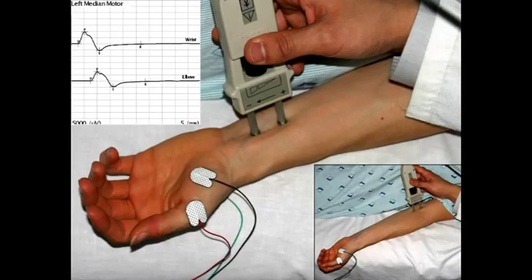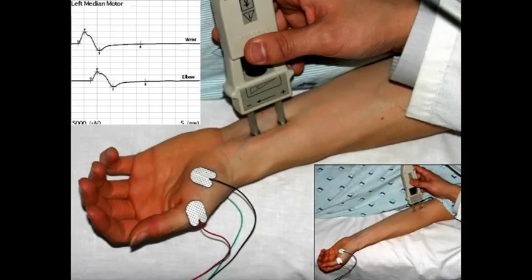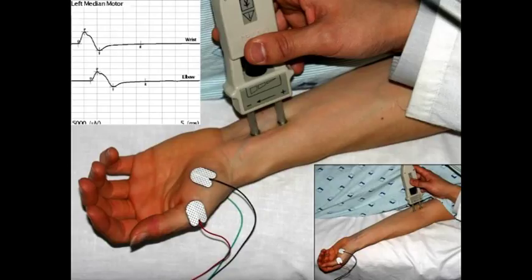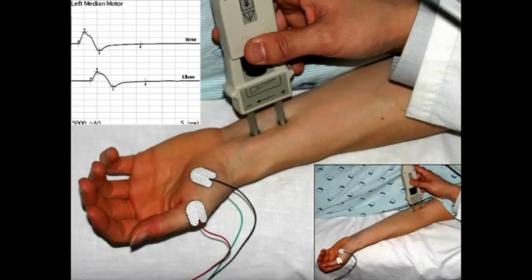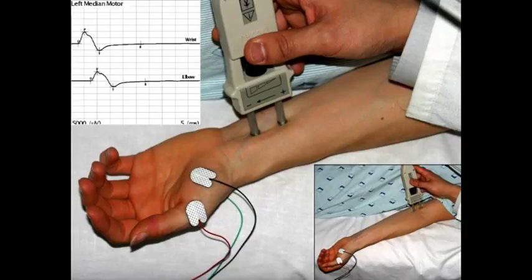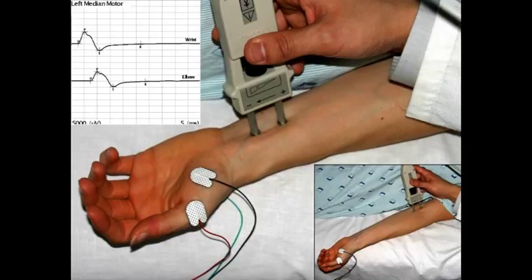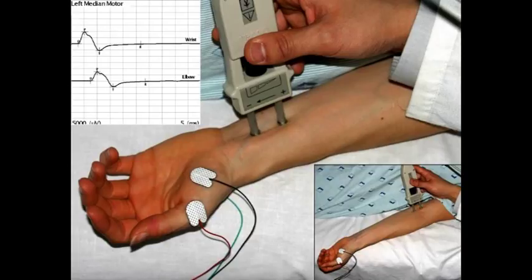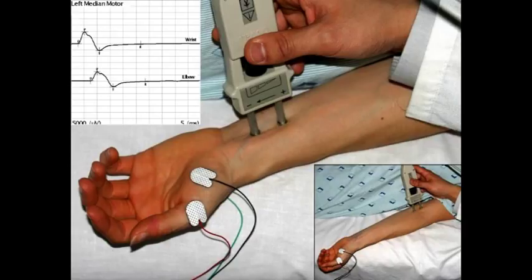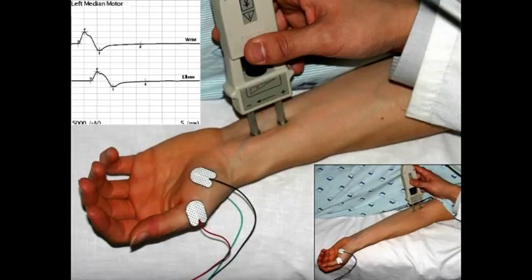There must be a heterogeneous population of nerve fibers within the median nerve supplying the motor nerve fibers to this muscle. If they were all homogeneous — the same diameter, same amount of myelin — this response would simply be a sharp spike. But it's not. The motor nerve fibers vary in diameter and degree of myelination. Those that are largest and most myelinated determine the latency of the response — the time it takes for this muscle to react to the arriving action potentials. This is called the distal motor response latency.